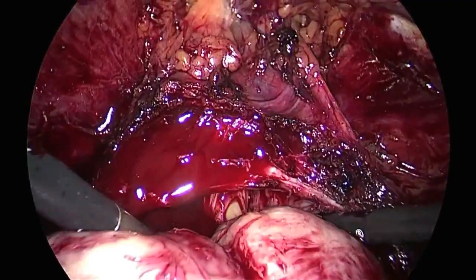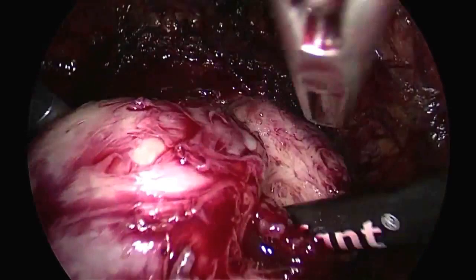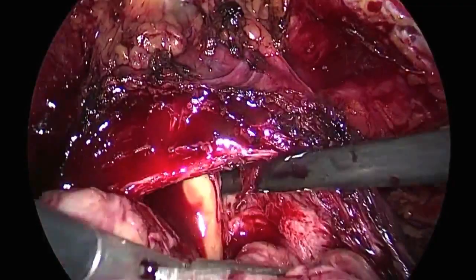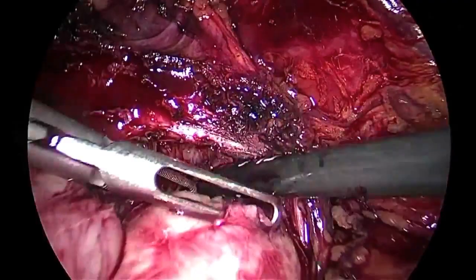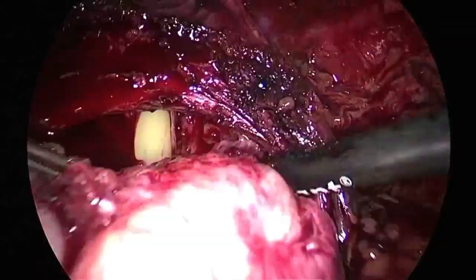Now, identify the urethra. Obviously, the catheter must be positioned in the urethra and in the bladder, and I dissect, and I perform a perfect enucleation. Now, posteriorly, can you give me the possibility to look here, in the right, okay.